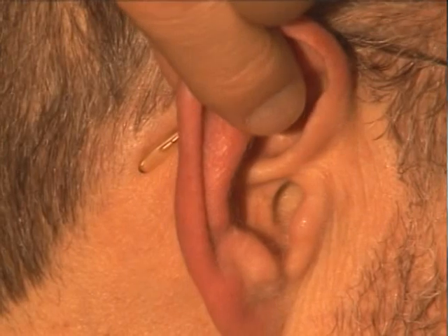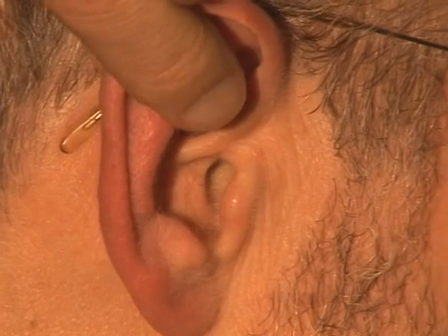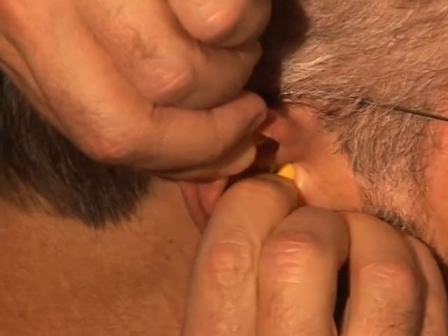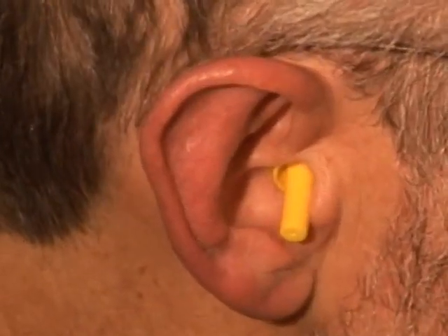For different people, the direction of pull will vary somewhat, but in all cases you begin by firmly grasping the ear between the thumb and forefinger and pulling it away from the side of your head. If you feel resistance as you begin to insert the earplug, then try pulling the ear in different directions, and what you may find is that suddenly the plug slides in more easily. Also, depending upon your ear canal shape and texture and your familiarity with the plugs, it can be helpful to moisten the plug before you begin.